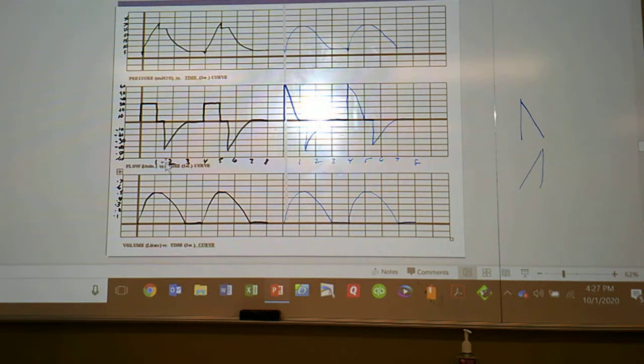And then it's going to go for the next breath up to 0.5, up to where this is, and then start here. So this is the start of the breath. From here, go up to 0.5 by 1 second. Pause, and you're going to have a flat part. Good. And then you come back to here. Right there, you got it. Square's exponential decay? Pressure controls, exponential decay. In a square, square pressure curves, yeah.